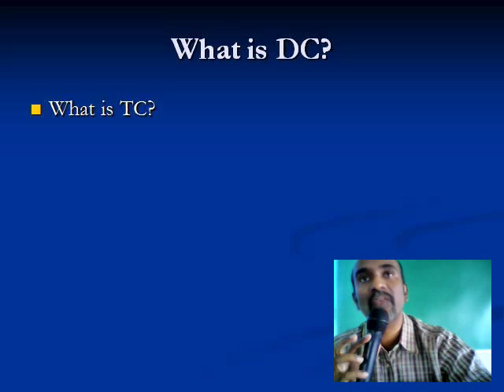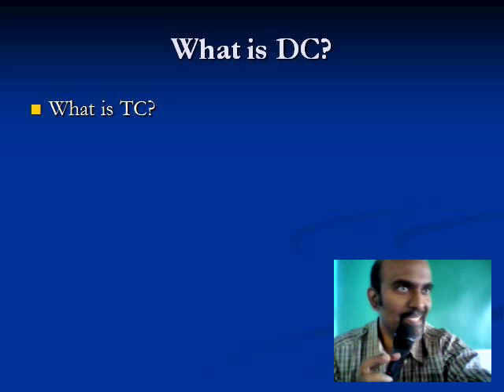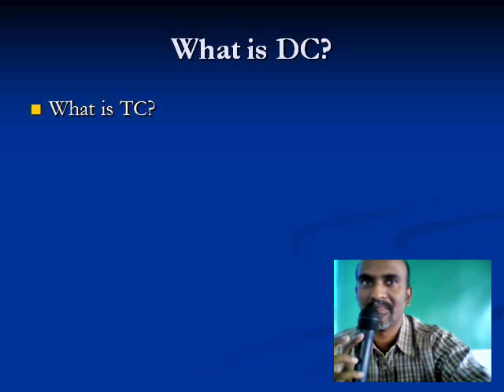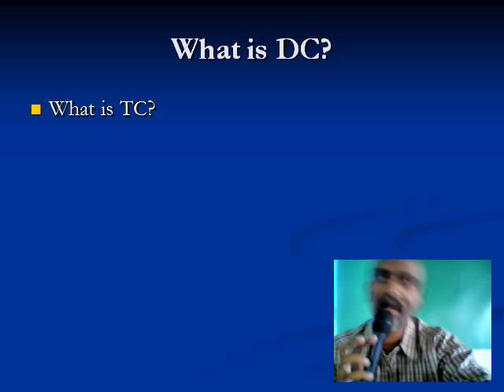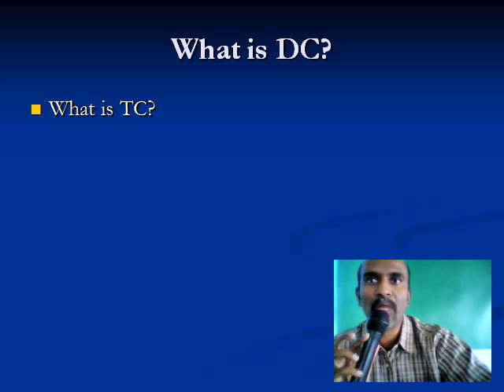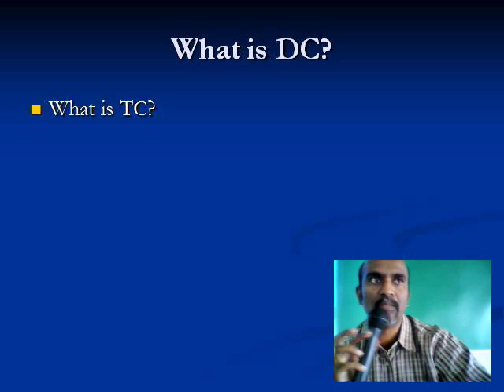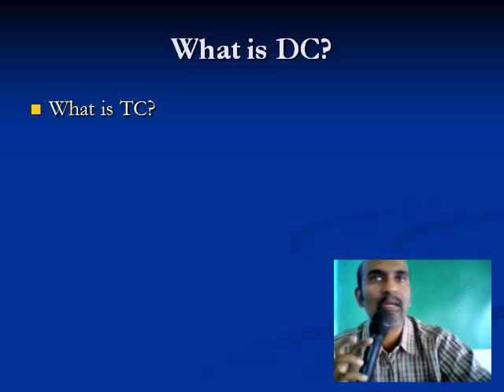Percentage. If 100 WBCs are counted, how many are neutrophils? If 100 WBCs are counted, how many are eosinophils? If 100 WBCs are counted, how many are the others? If the examiner asks you what is differential count, you say I count 100 WBCs and tell you how many individual cells are there expressed per 100, or percentage.